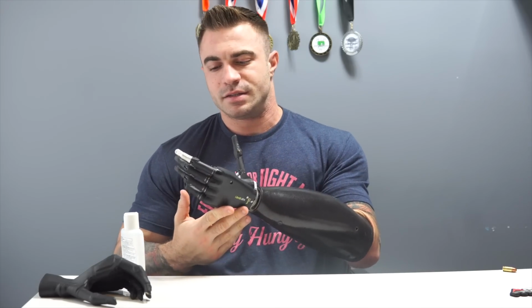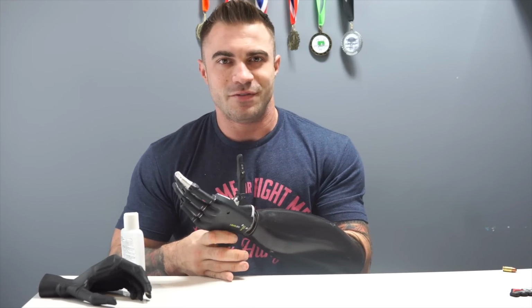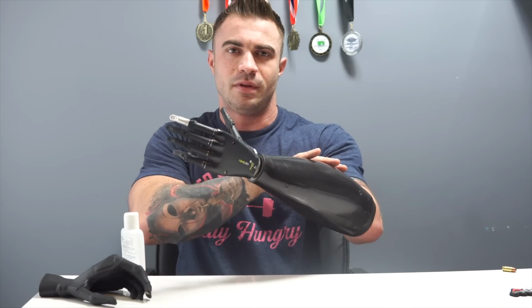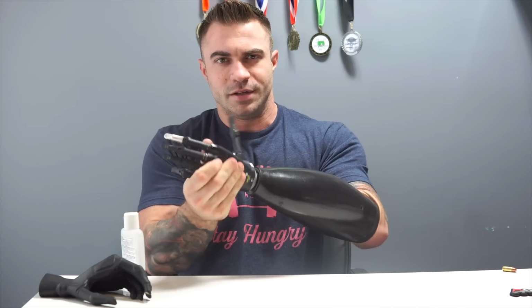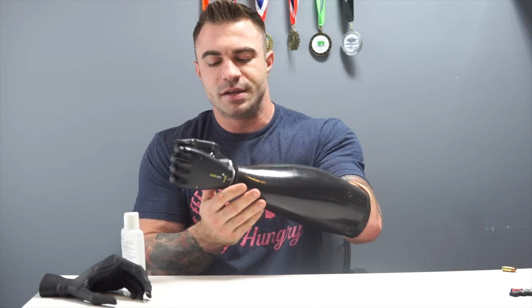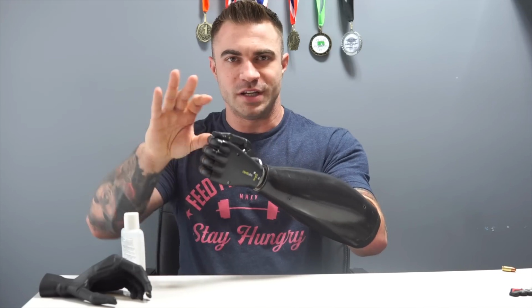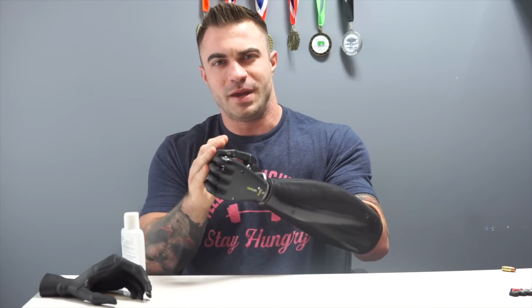Having a hand like this, obviously this is a lot more advanced technology, which means there's a lot of gestures, a lot of things it can do, a lot of settings and scenarios and different movements that I can help position it manually or pick up the signals from the myoelectric devices. I can move the thumb manually and I can move the wrist manually. Some people have a wrist actuator, a wrist attachment that they can control the wrist movement. I opted not to get that because it would be another inch and a half that would make it hang even longer, and I don't want to look like I have an orangutan arm.